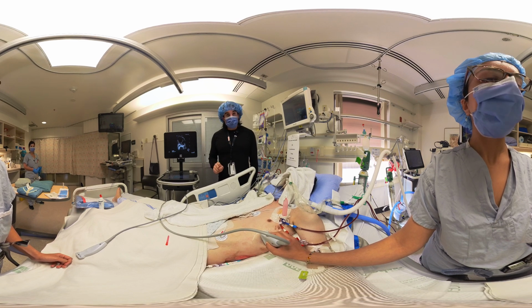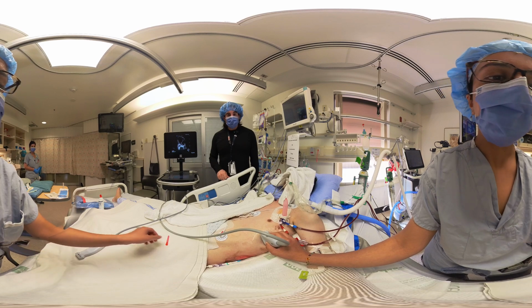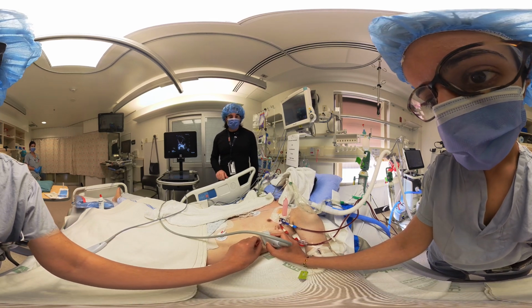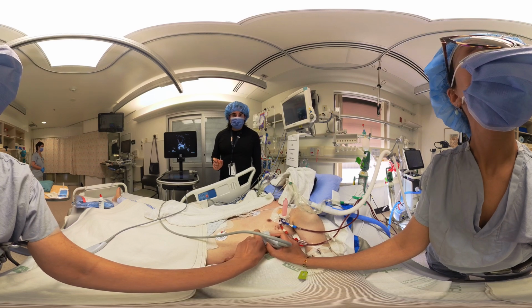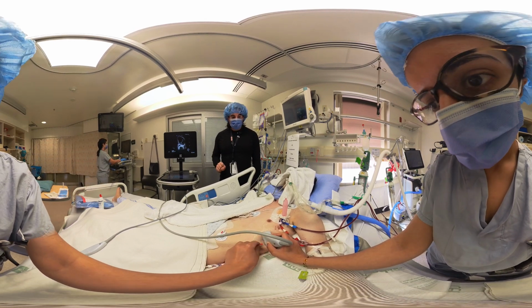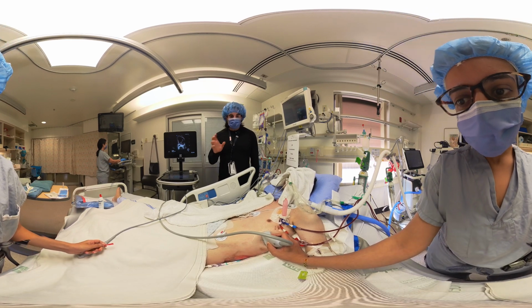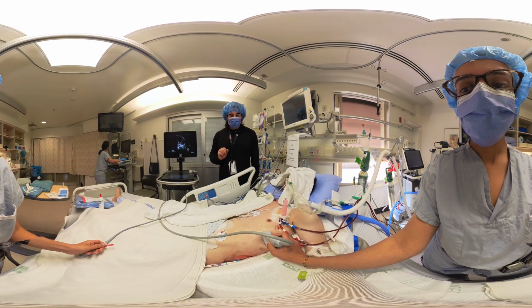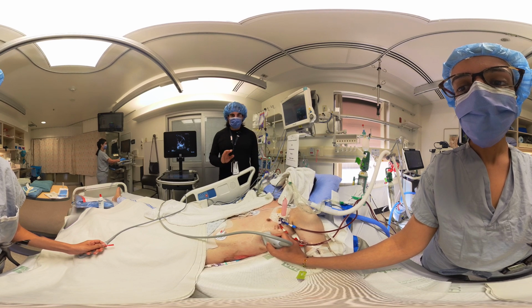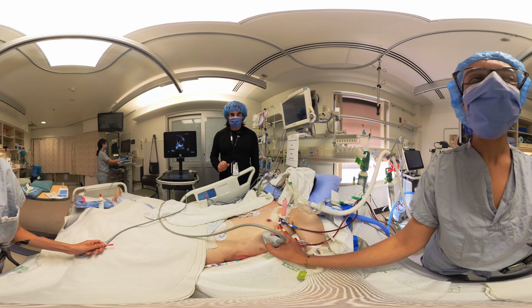Let's mark this area with the blunt fill cannula, again, just the blunt end, and we're going to mark there in advance. This is more of a static guidance technique where we mark in advance, then we're going to prep and drape the area. So once we're happy with this, we're not going to change positions. The next thing after this probe's applied and we're satisfied with the position is we're going to apply the linear probe to make sure there's no vessels in the area.